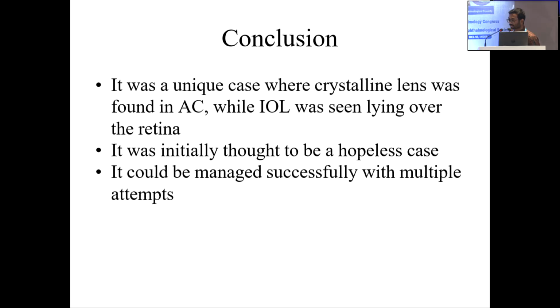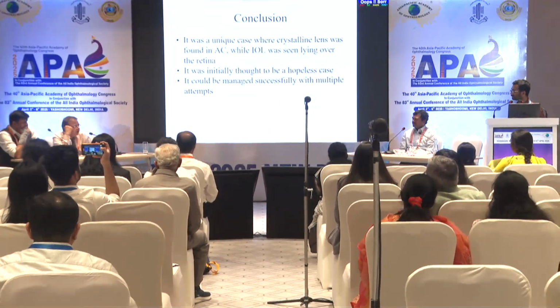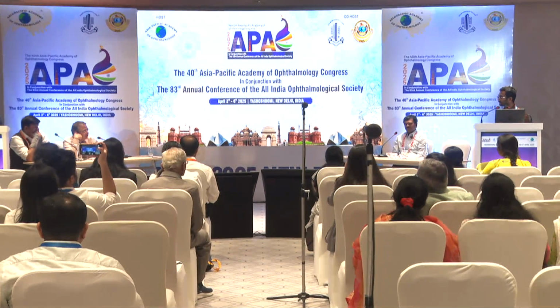So, how did you prevent the oil from coming into the anterior segment and touching the cornea? What did you do at the end of the surgery to push the oil behind?